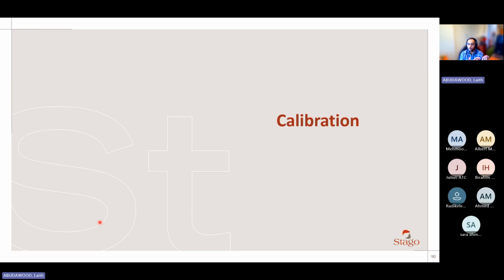Because often the thing you are measuring on the analyzer, optical density, clotting time, lumens, for example, cannot be reported to the clinician, right? So for example, when you work with chemistry, a lot of the time you are using optical density. Can you report optical density to the clinician? It has no meaning. So you have to teach the analyzer that if you see this thing that you are measuring for this reagent lot, for this parameter, convert it using this formula that I will teach you to give me a value that I can report to the clinician or to the patient. This is what calibration does, very, very simply.